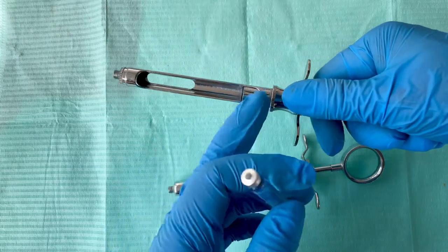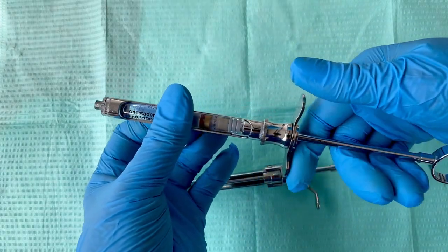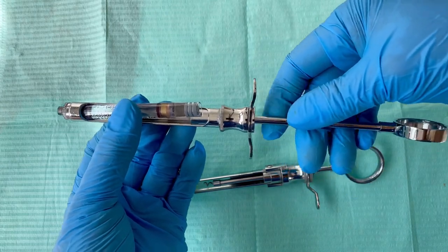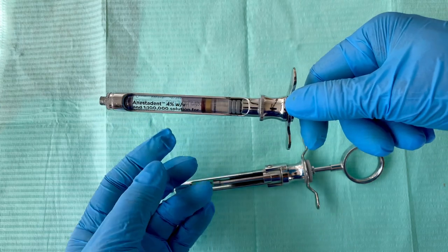If you don't pull the handle, your cartridge won't fit in your syringe. So you always have to make space for the cartridge by pulling the handle like this.